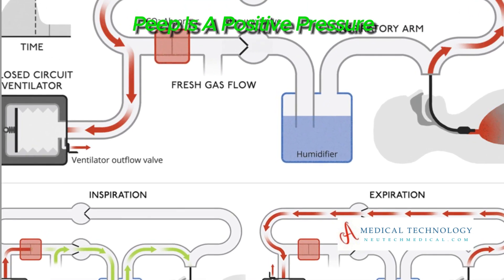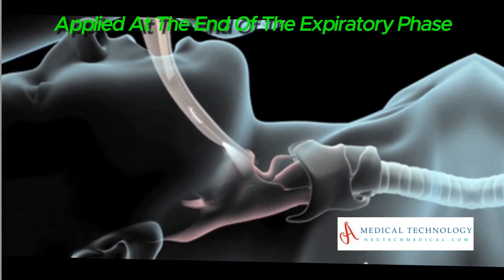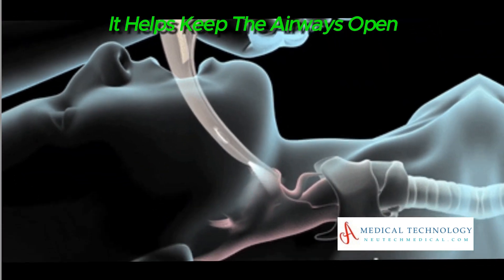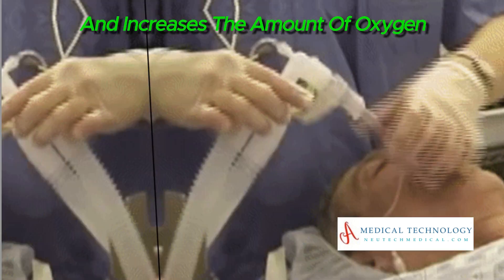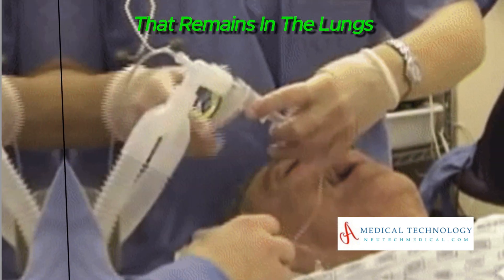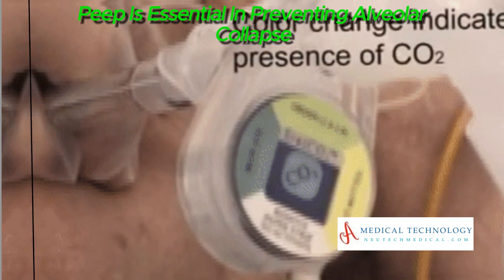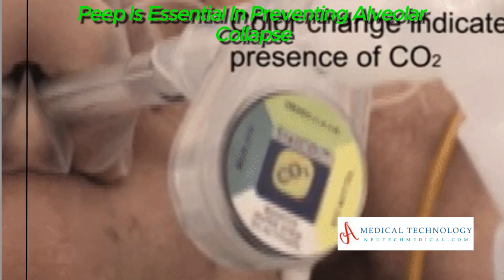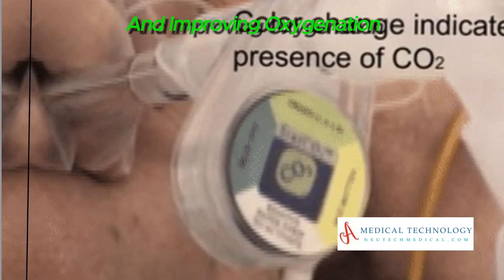PEEP is a positive pressure applied at the end of the expiratory phase. It helps keep the airways open and increases the amount of oxygen that remains in the lungs after each breath. PEEP is essential in preventing alveolar collapse and improving oxygenation.